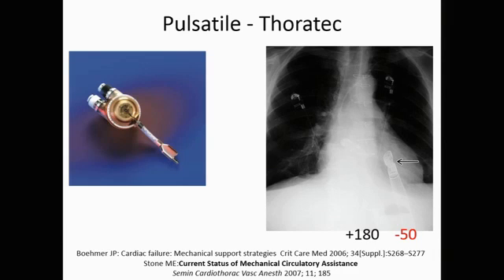The other thing is that there's a significant resistance in the outflow cannula of all these devices, so the device is generating a much greater pressure at the outflow of the device than you'll measure in the arterial circuit, because there's a huge resistance loss of pressure through the aortic cannula of these devices.